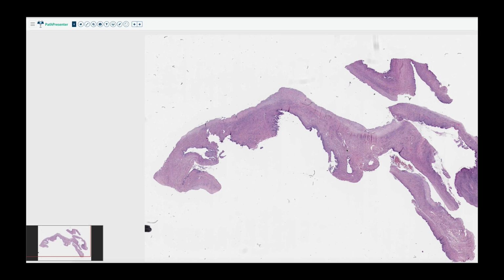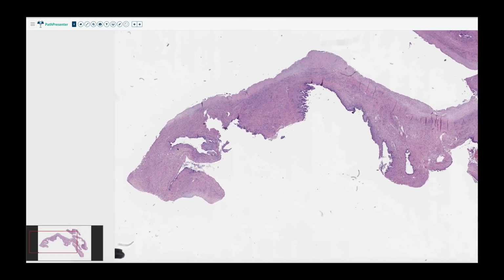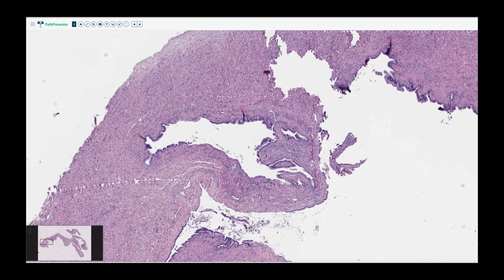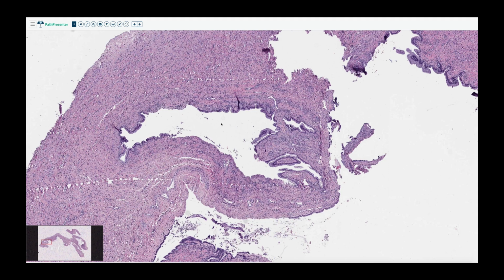So this was probably a cystic mass, right? And this stuff out here was likely the surface of the ovary, with this stuff being the inner surface. That's why it always helps to stick a little bit of ink on that tumor at frozen section or when you're grossing it. So when you're under the slide, sometimes these cyst fragments can get twisted around and shoved together, and you want to see what you're dealing with.